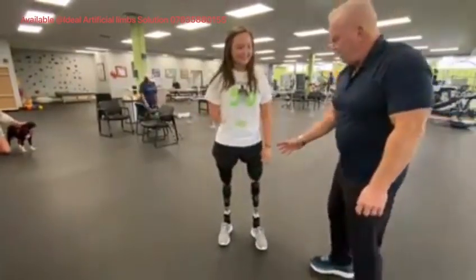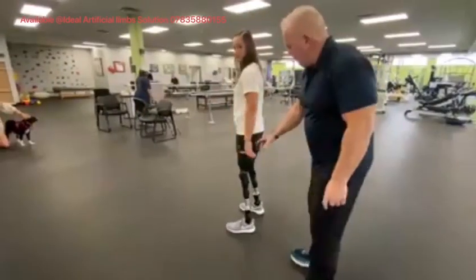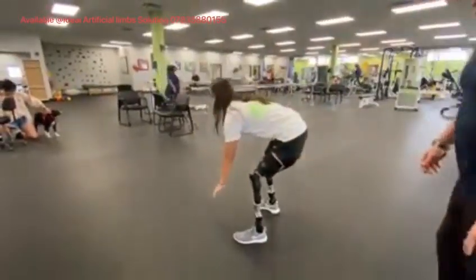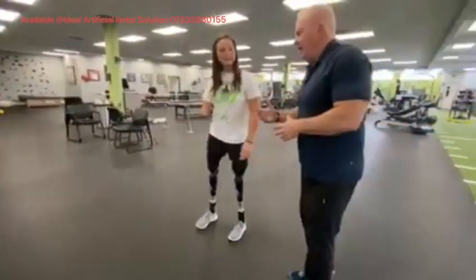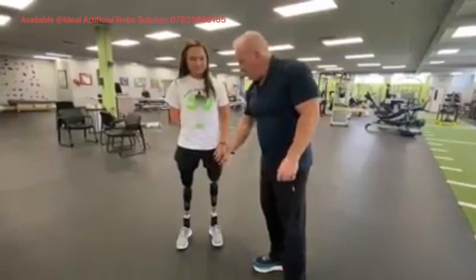It gives her propulsion. She's able to bend down and touch the ground and fire her muscles without the knee giving, because she can stabilize everything with the muscles. She's already seen her legs really tighten up, and she's been wearing it because she can actually fire her muscles.